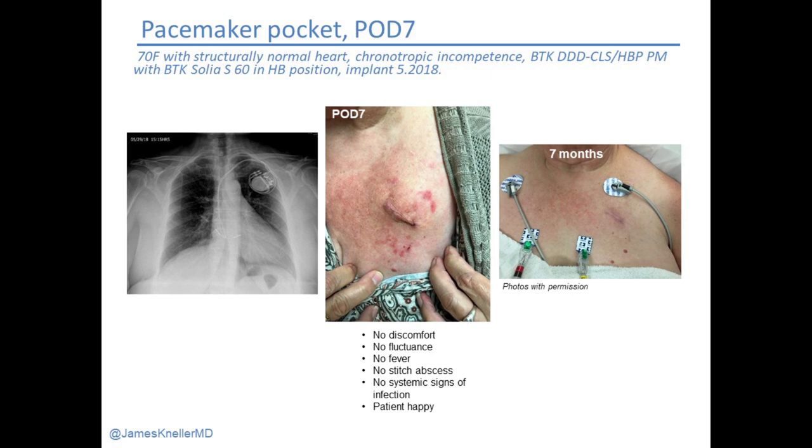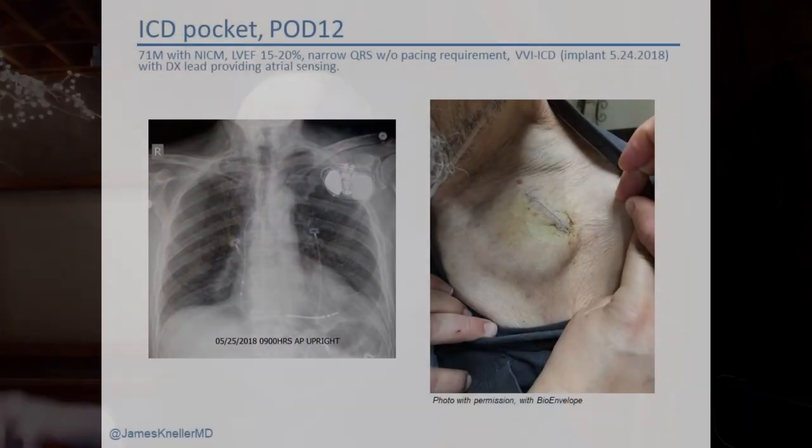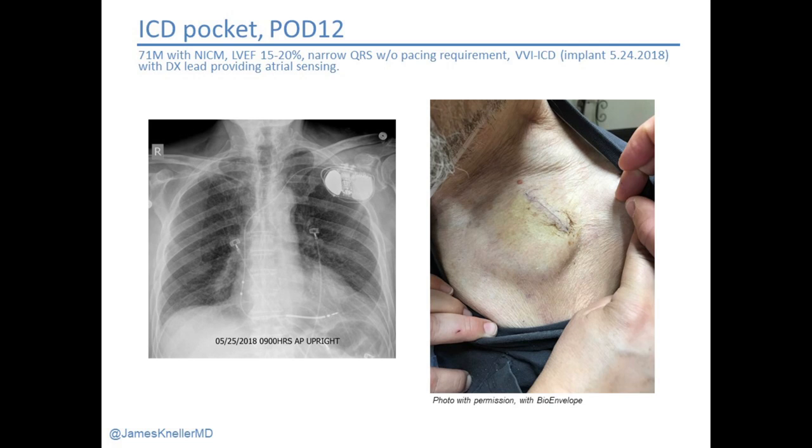We are going to have to revise her pacemaker down the road because she's insisting on pocket pain — something that really surprises me. I like to have the generator over the lung field on a PA radiograph, which looks very nicely positioned, but it turns out it wasn't quite right for her. I will revise these for people if they convince me it is uncomfortable. Here's an ICD two weeks out — scar is very nice and tight. The little lumps and bumps are a result of sutures pulled tightly together; that will all flatten out. The device has a bigger contour, but no signs of dusky or red skin. Looks like a happy ICD.